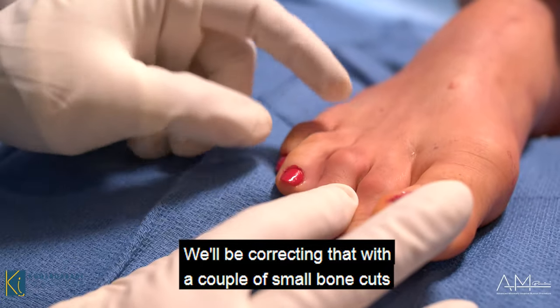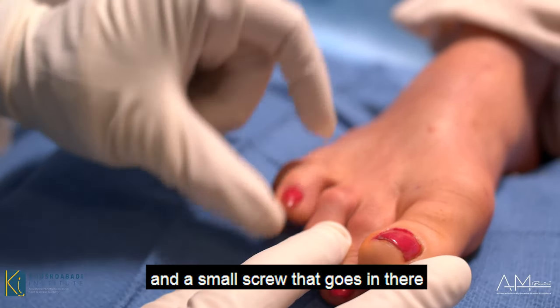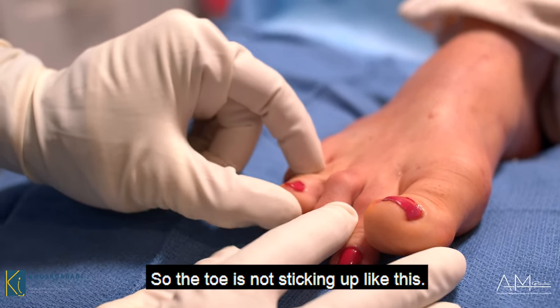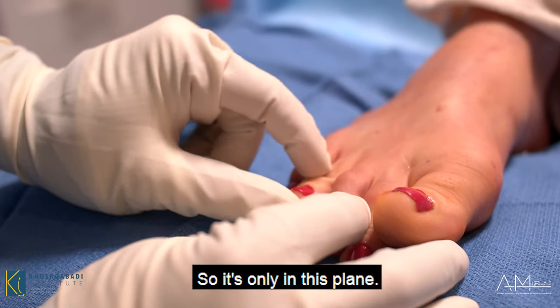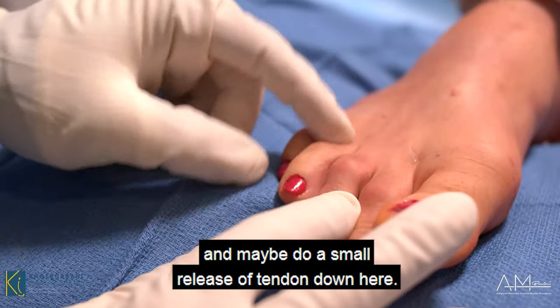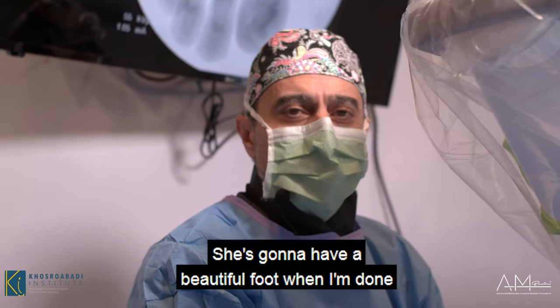She also has a hammer toe deformity right here. We'll be correcting that with a couple of small bone cuts and a small screw that goes in to keep it straight. Fortunately she doesn't have a deformity in the vertical plane — the toe is not sticking up — so it's only in this plane. All we have to do is correct this and maybe do a small tendon release down here.